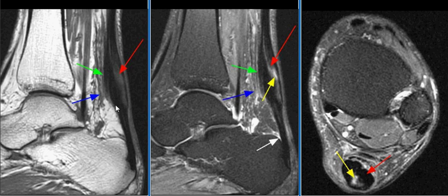There is a trace amount of retrocalcaneal bursitis. The findings are consistent with non-insertional Achilles tendinosis with peritendinitis.